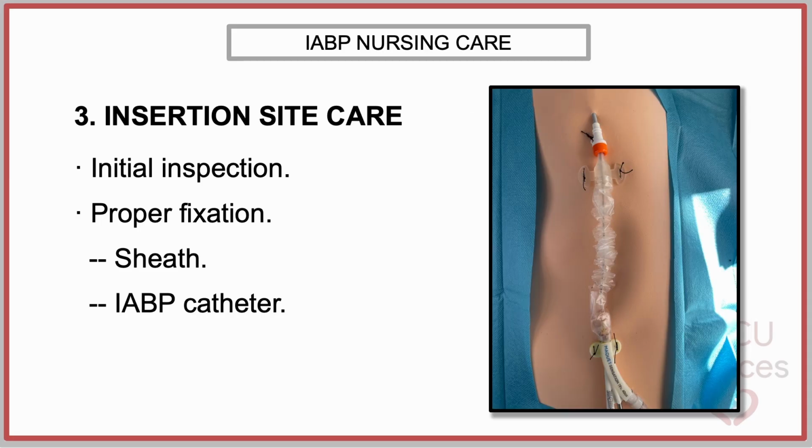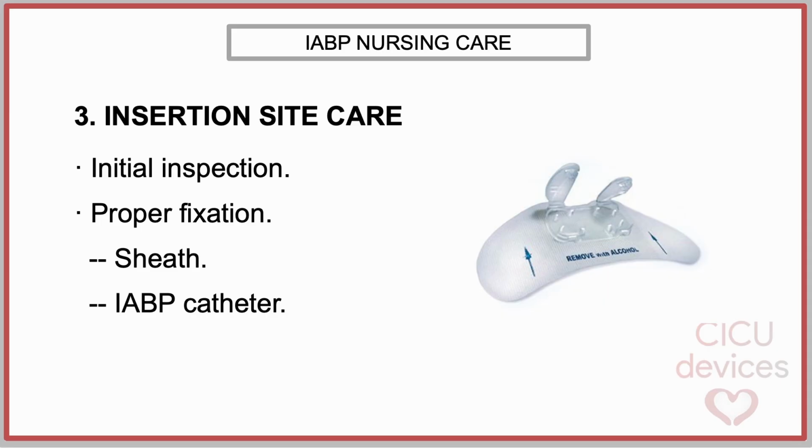With regard to fixation of the IABP catheter, securement to the skin may also be achieved using sutures placed according to the manufacturer's recommendations. However, dedicated catheter stabilization systems represent an alternative method of fixation. Adhesive securement devices specifically designed for IABP catheters, such as StatLock systems designed for IABP, can provide stable fixation without the need for additional sutures at the catheter shaft.